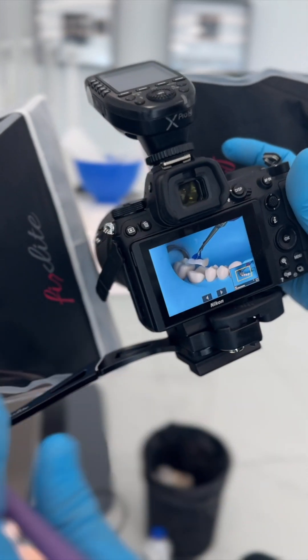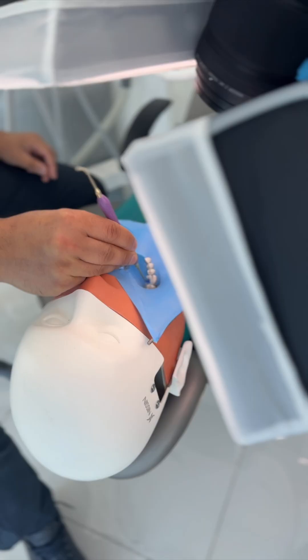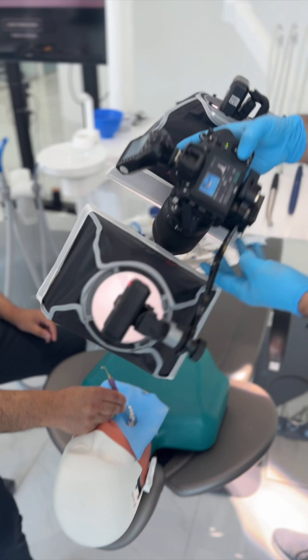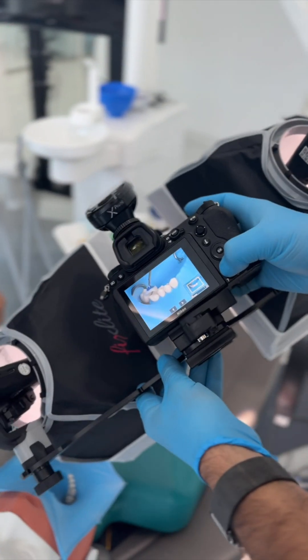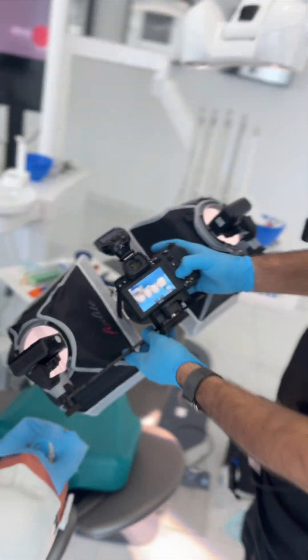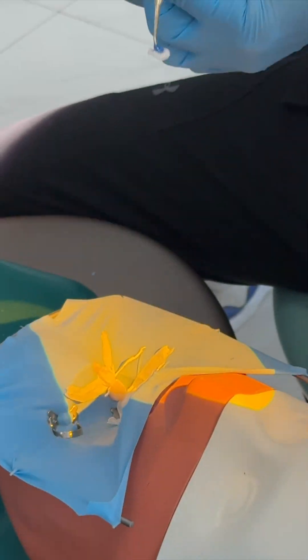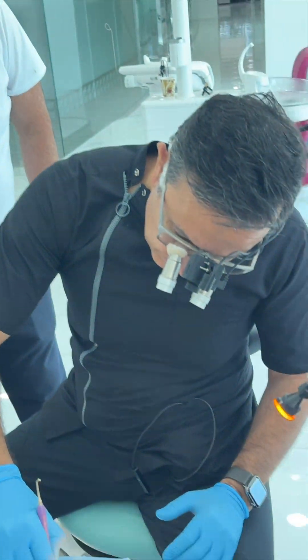It can be nicer — let me check. Down, down, down. Okay, don't move — this is nice, this is beautiful. You'll have this nice excess, which looks good in the photos. By moving your hand left and right you are pressing the ceramic.